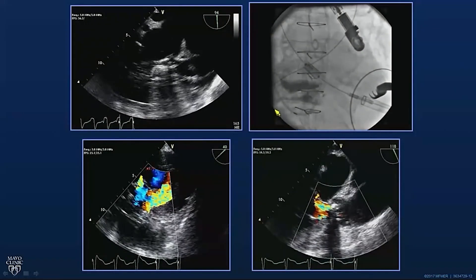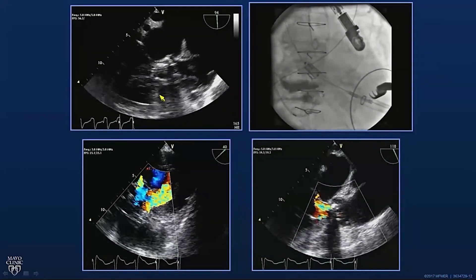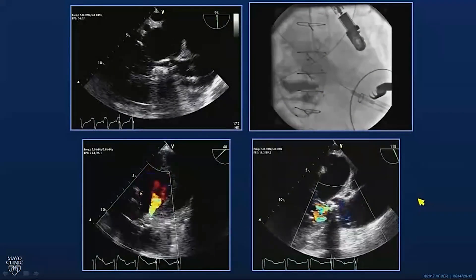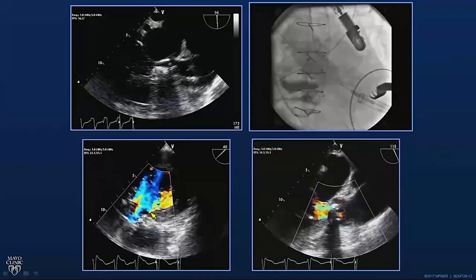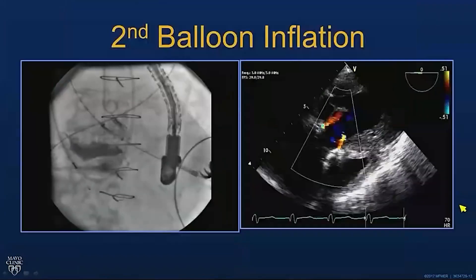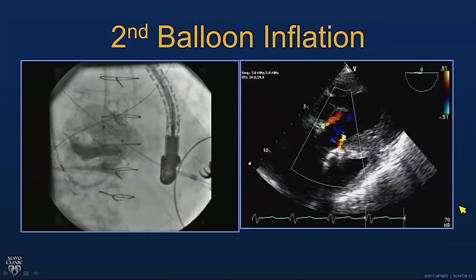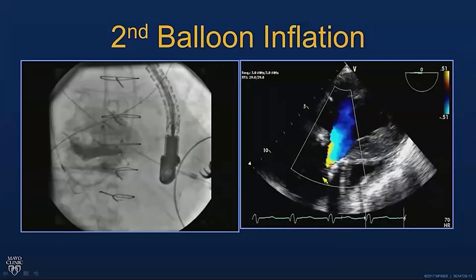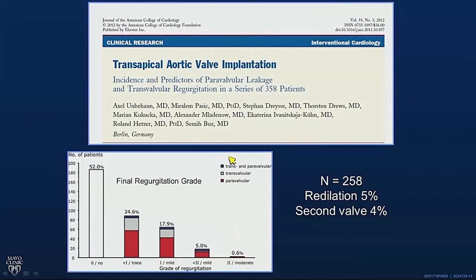Here's a case where we're deploying the TAVR valve — one of the rare cases where they didn't ask us to pull back the probe. We see a lot of periprosthetic regurgitation here; whether you call it moderate to severe or severe, it's way too much to leave behind. The decision was made to do a second balloon inflation, and after that the result was much better, probably mild residual regurgitation. In early transapical TAVR series, a second inflation was needed in about 5% of cases and a second valve in about 4%. With newer prostheses, this is much, much rarer.